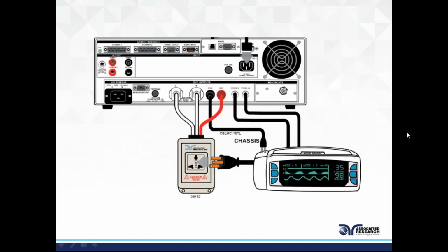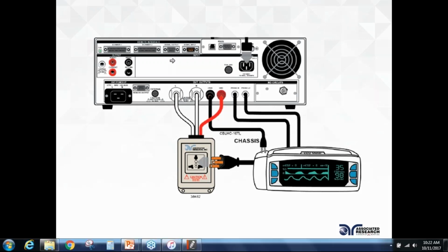So how do we do this? We want to make sure that when we say a measuring device, the measuring device is internal to our instrument. If you take a look right here, this is our device, the 8206 or 8200 series Omnia 2 instrument. You have a medical device here that's going to be plugged into an outlet that comes out of our medical Omnia tester. It's going to provide line, neutral, and ground connection points.